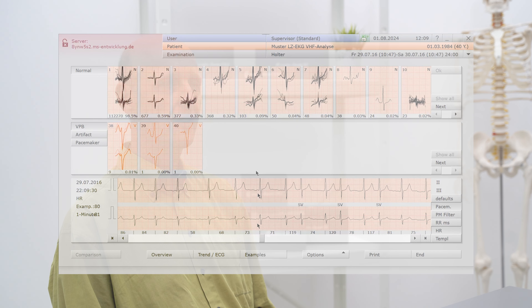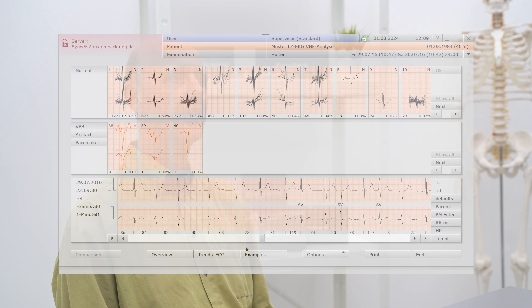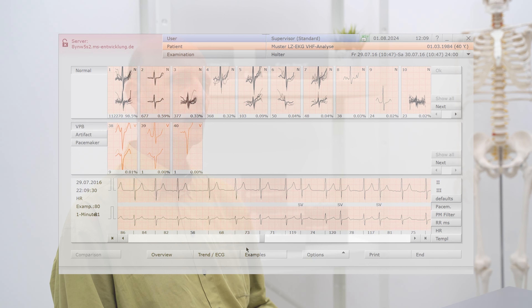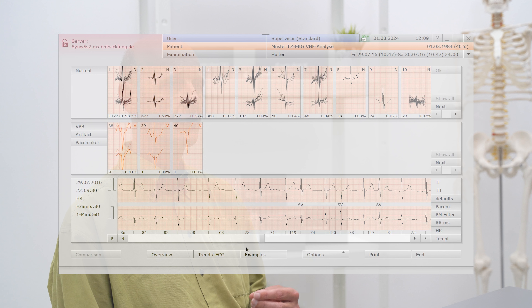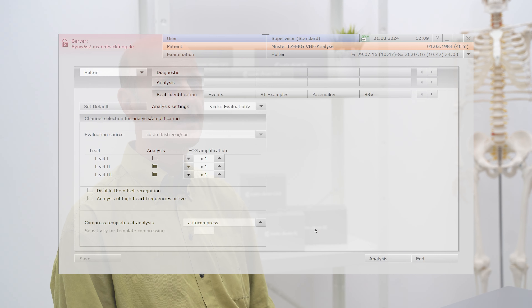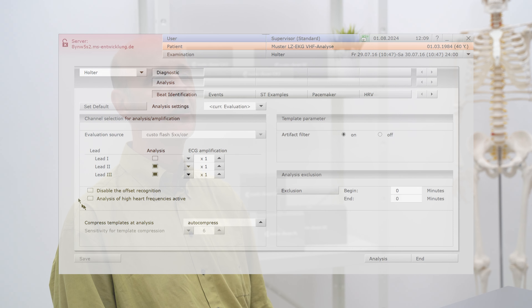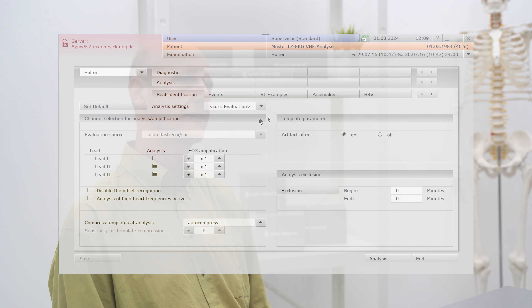If you want to process this ECG further, you will remember from the old versions that you can find this on the analysis page under options and parameters settings — for example for offset detection, or in the case of tachycardic basic rhythms, for the detection of high heart rates.